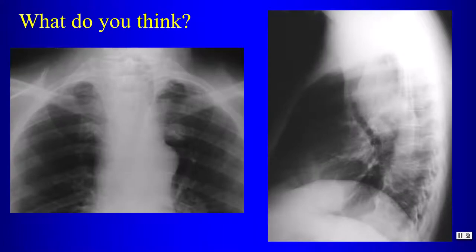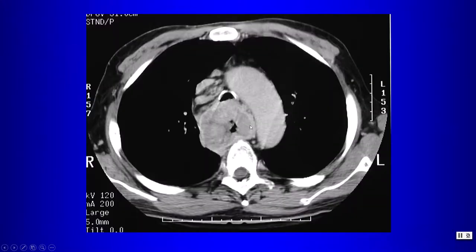Next case showing tracheal deviation, especially on the lateral view, with soft tissue impinging on or invading the posterior tracheal wall. What lives behind the trachea? The esophagus. We need to be concerned about esophageal neoplasm — on CT there is circumferential narrowing of the esophagus, confirming esophageal cancer.